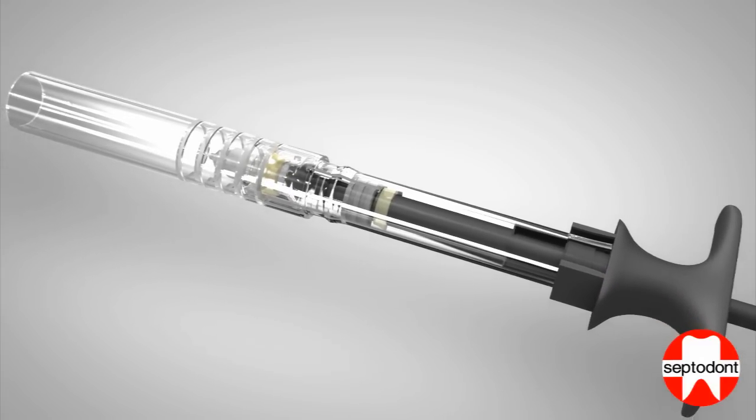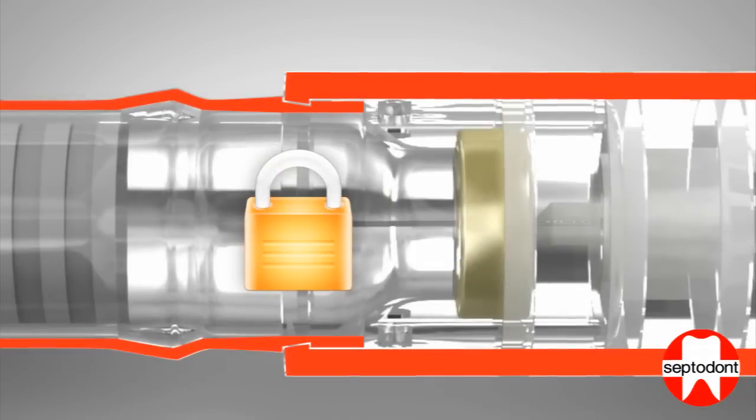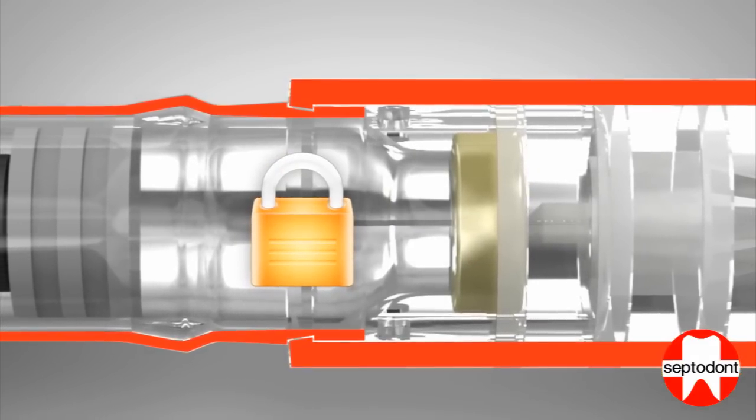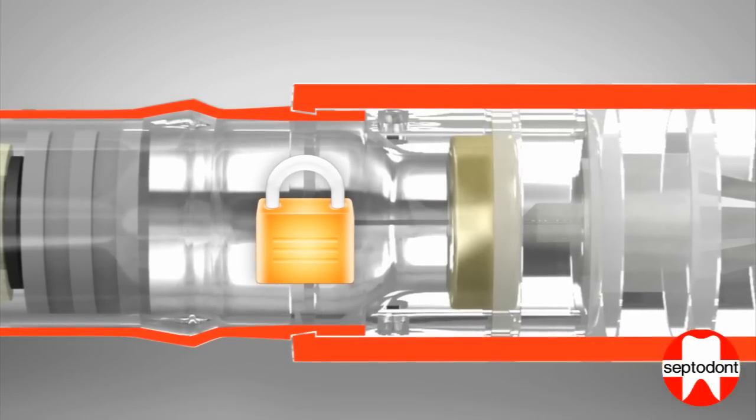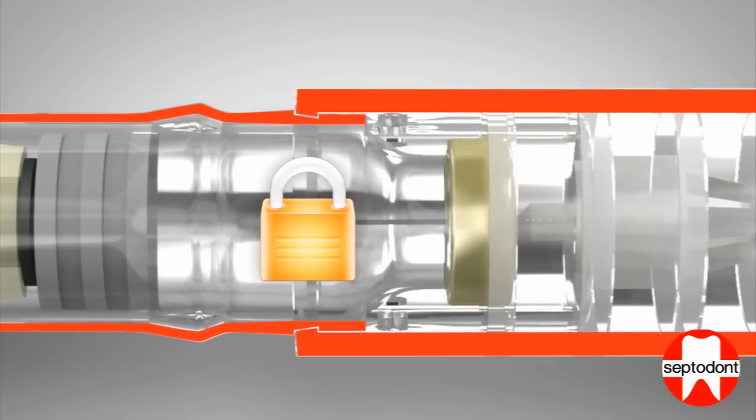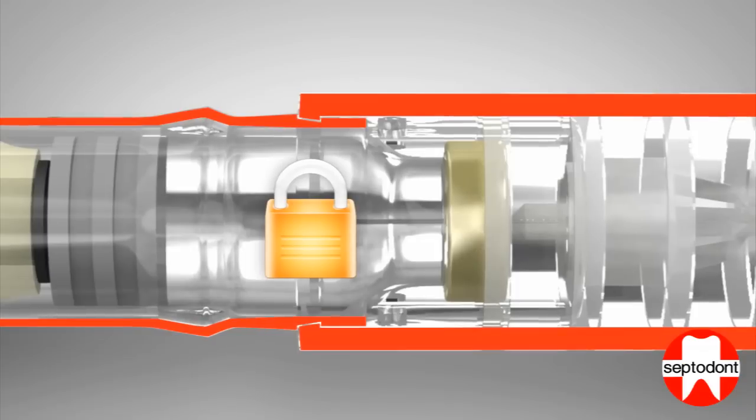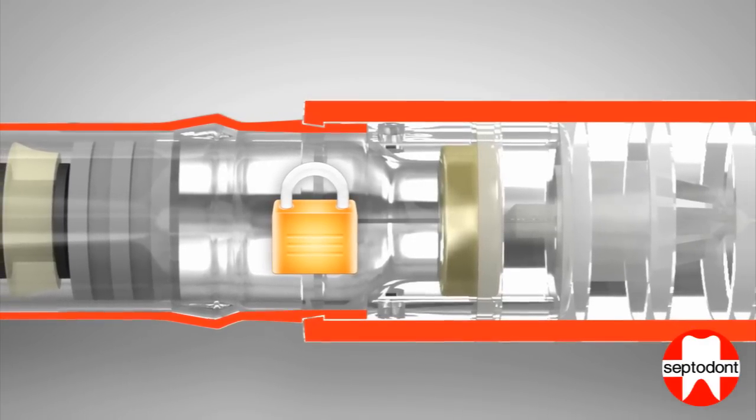Warning: When the device has been locked, do not try to force the protective sheath off the locked position. Instead, the syringe should be disposed of safely and a fresh syringe assembled to complete the procedure.